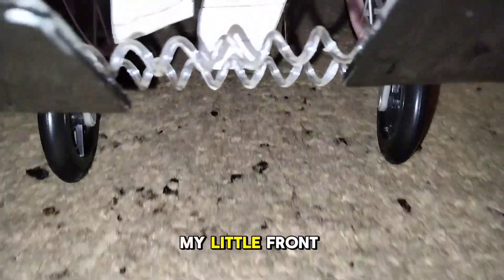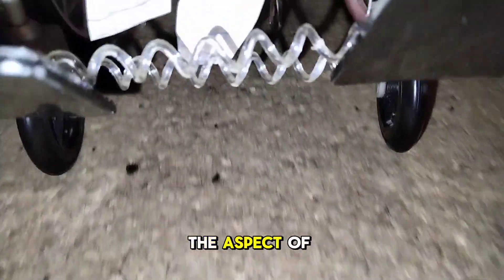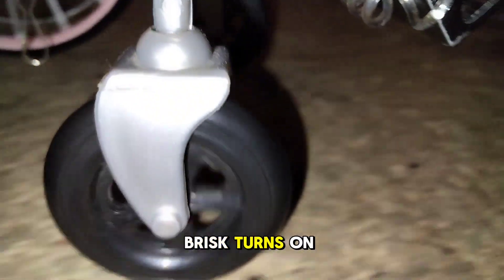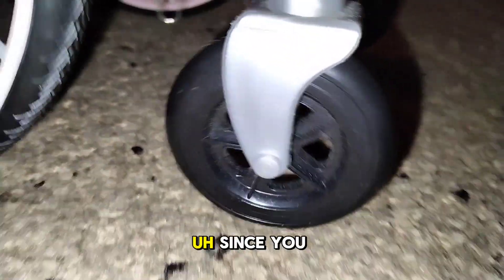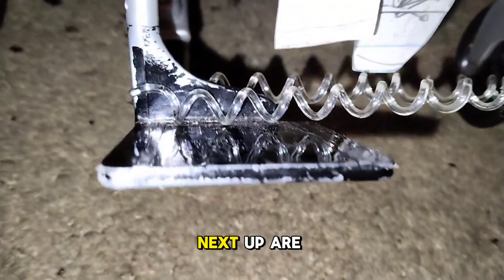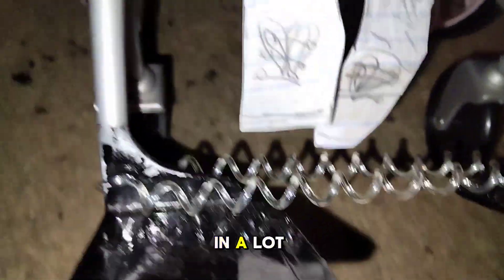Next up is my little front wheels. Now these do serve a purpose, but not in the aspect of holding things. They just mainly help me drive my chair, help me make swift, brisk turns on the dime, since they help in that aspect of giving excellent support.